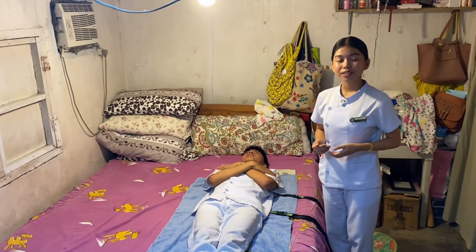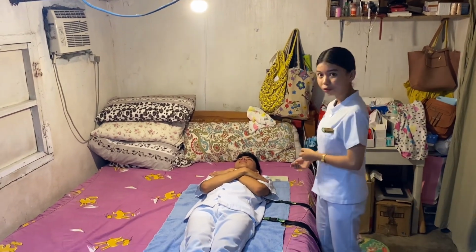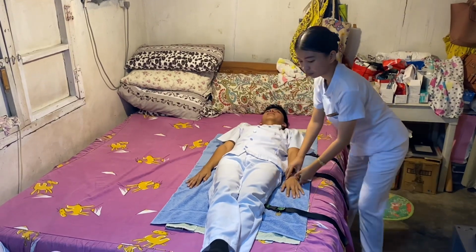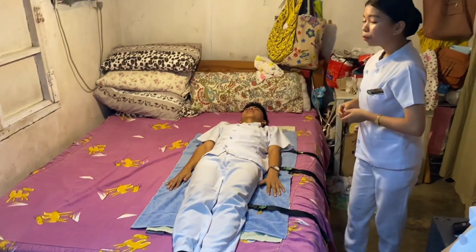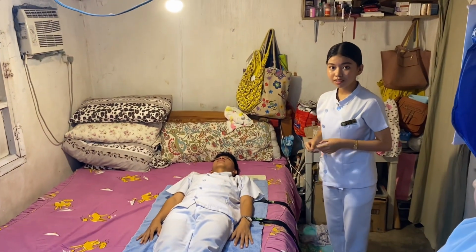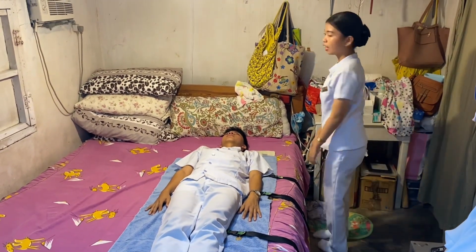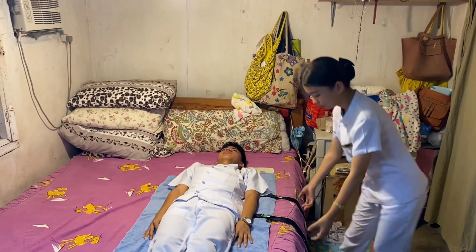Now we're going to proceed on making the client comfortable by fixing his position. Okay, so now we're going to unlock the wheels of the stretcher. As for the stretcher, we're going to pull it away from the bed.